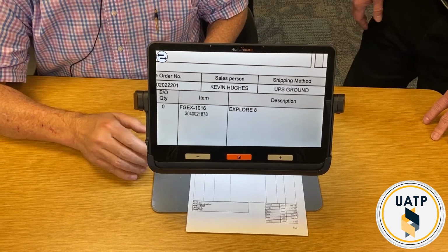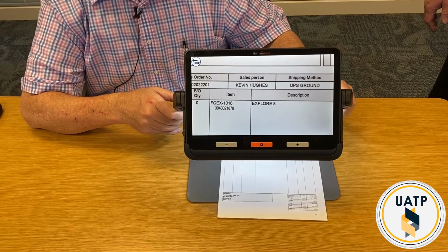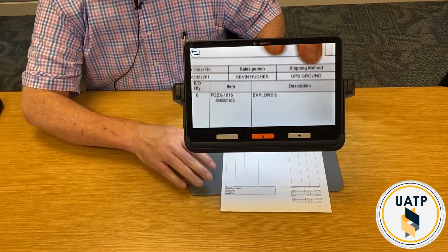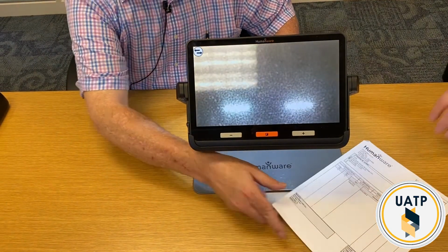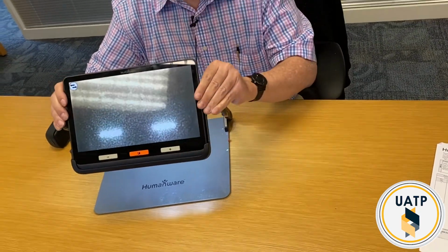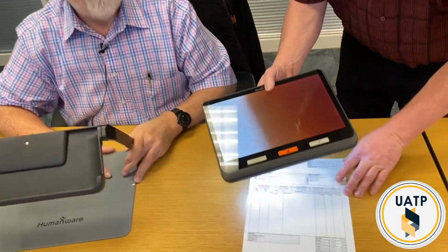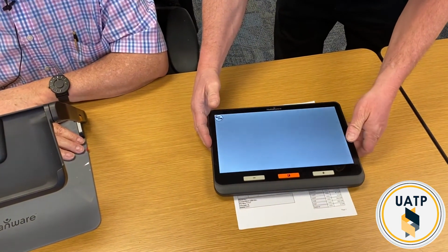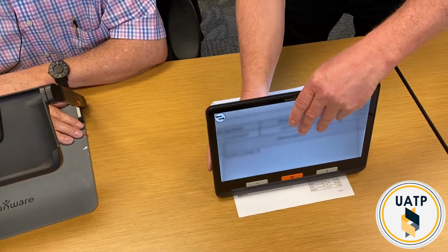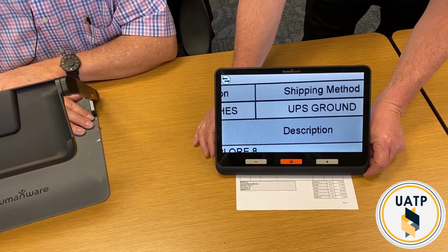You can use this 3 different ways. As it is now, it's on the stand. And this stand is designed so you can put a book or a paper or whatever under it. You could read, you could write, that sort of thing. I'm going to take this off, and I'm going to move it over here really quick, and then I'll take it off and let Neil show you what it looks like the other ways. Here's this one. So you can just lay this on top of the page. That doesn't do very good. Flip the stand up. You probably want the stand up to do that. So, go ahead and describe.